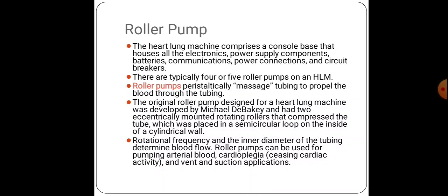Cardioplegia means the ceasing of the cardiac activity. We just stop the cardiac activity, and that is called cardioplegia. Vent is for opening and suction applications. For arterial blood flow, cardioplegia, vent and suction application, we are using the roller pump.